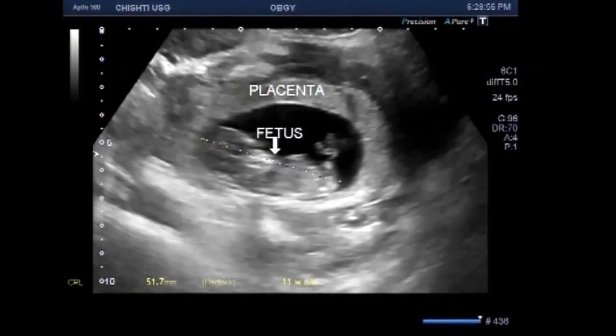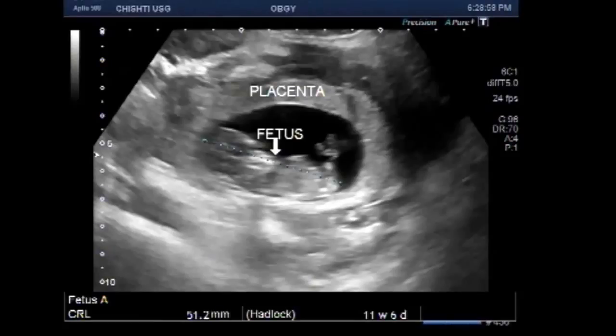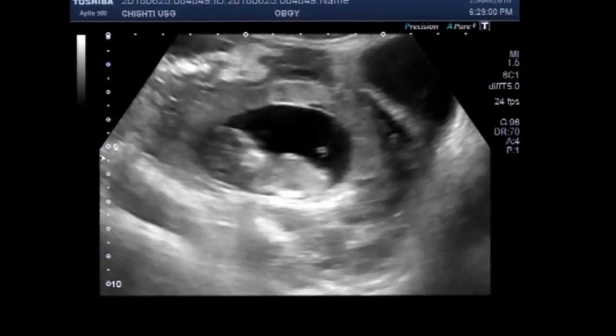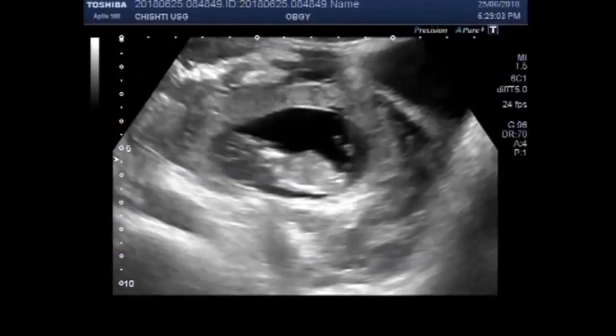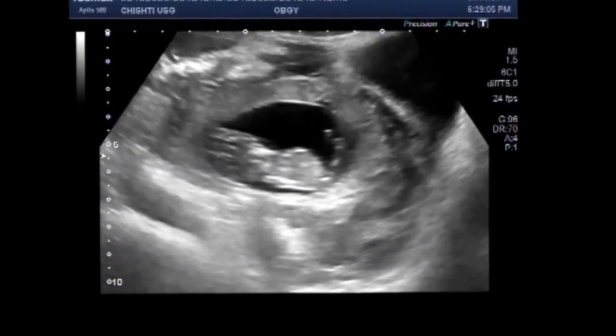You can see the duration of the pregnancy. It is almost about 12 weeks. Now you can see the fetal movements.